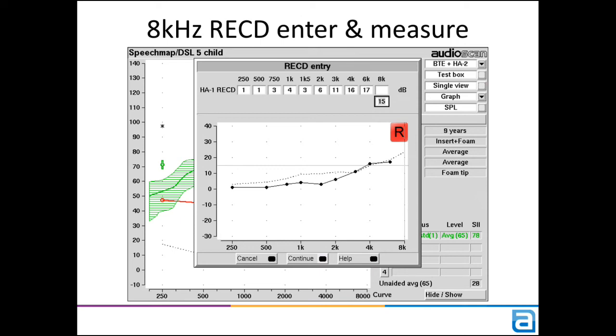An important note, if you have a 9-point measured RECD from current software, they'll still be valid in the updated software. The entry screen will accept an empty field for 8 kHz if you don't have it, and automatically do a straight line interpolation before you run SpeechMap.